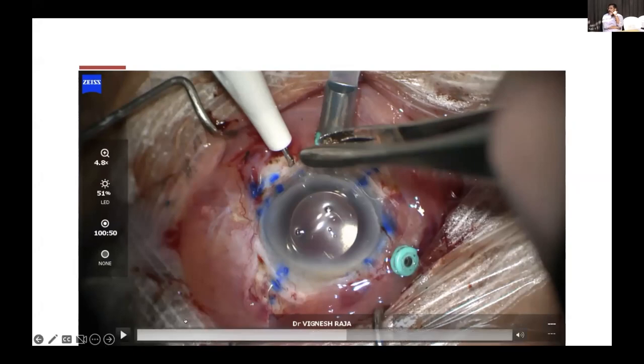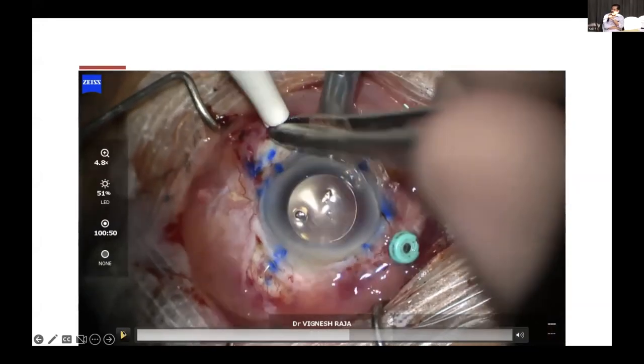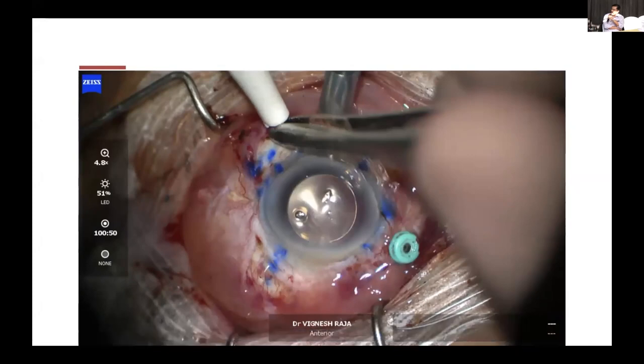So it's a 1-1-1 sliding slip knot. First one and second one in the same direction, and the last one to lock it? No, first one is a normal cross. Second one is where the suture goes over the needle holder. The needle holder does not come within the throw. It comes above it. Like how we lock the last suture, we do it as the second step.